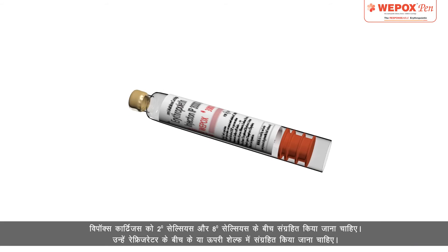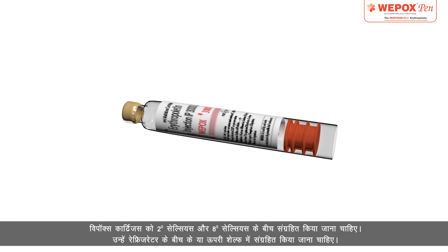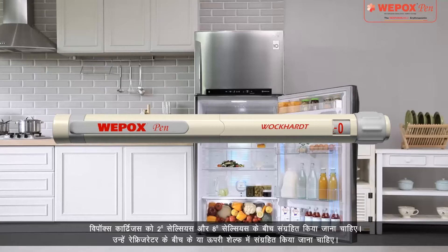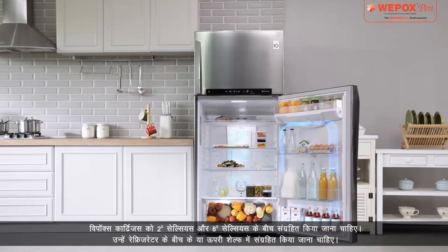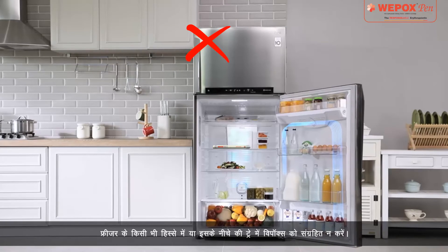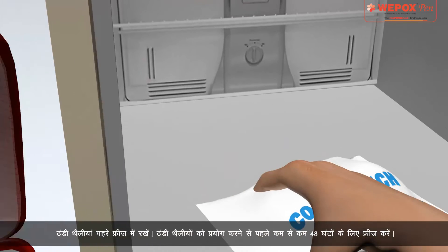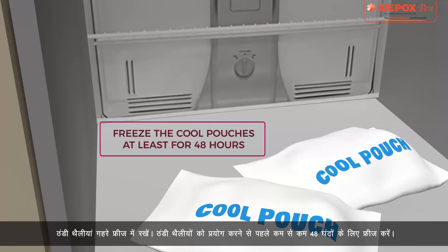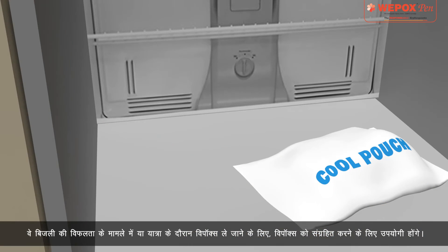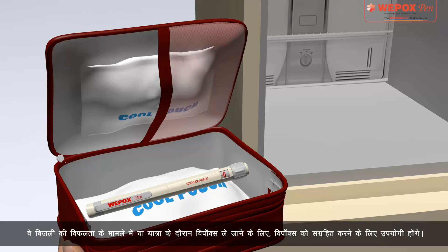Storage: Wipox cartridges should be stored between 2°C and 8°C on the middle or upper shelf of the refrigerator. Do not store Wipox in any section of the freezer or the tray below it. Keep cool pouches in deep freeze — freeze them for at least 48 hours before use. They will be useful to store Wipox in case of power failure or while travelling.